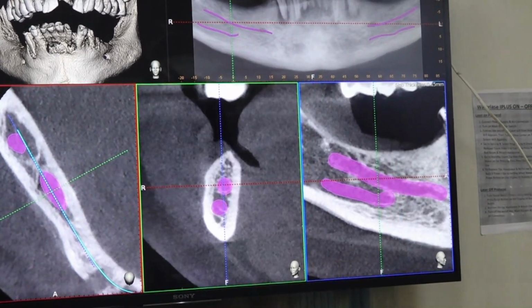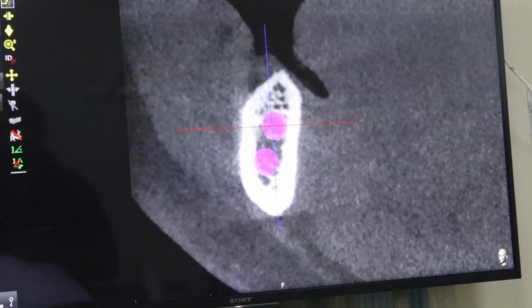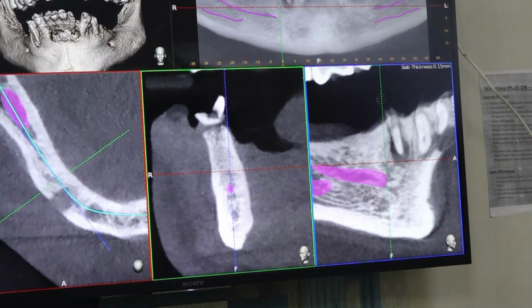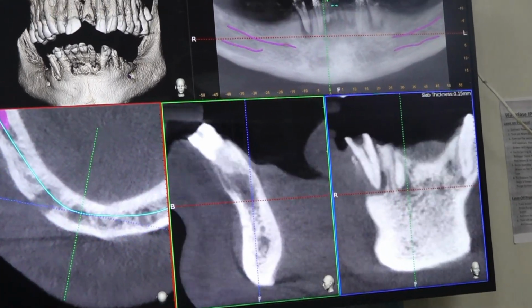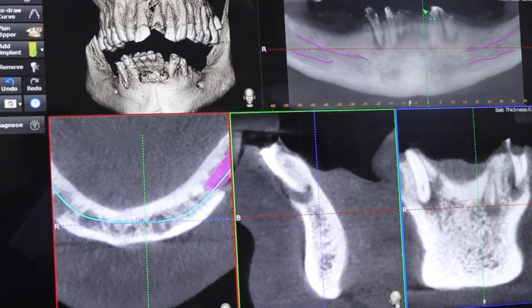So in the 7 region it is more worse. So using distal mandible is not favorable in this situation. So we have to plan only interforaminal. Luckily interforaminal bone is somewhat good, even though there is periapical lesion.